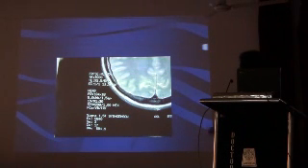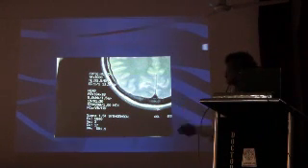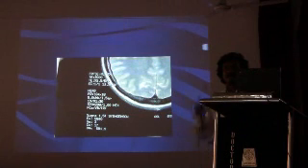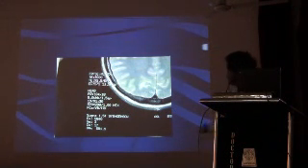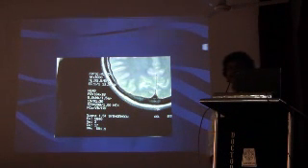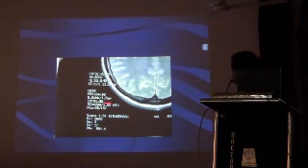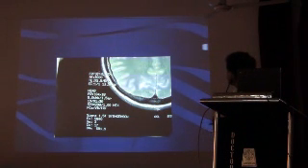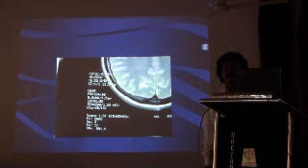TR is 3000, so long TR. TE is usually around 100 or 200. So long TR, long TE equals T2. So these two things you have to look at. Only these two. You forget all this: field of view, slice thickness, etc. Okay? So this part is important to see what type of image, TR or TE, you are dealing with.